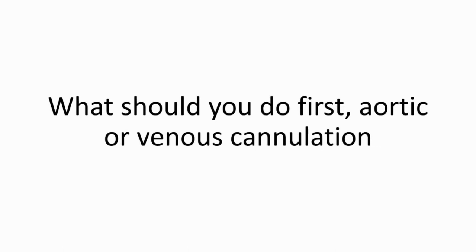Okay? So with heparin, you give an intravenous big shot of heparin, and you measure the impact of heparin in real time in theatre by taking blood samples from the patient at time intervals after giving the heparin and measure what we call the ACT. Okay, the ACT is a measurement of the action of heparin, and it stands for the activated clotting time.